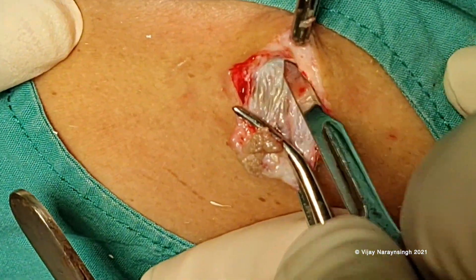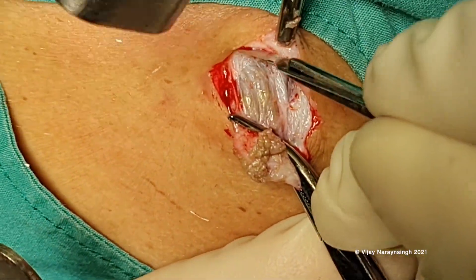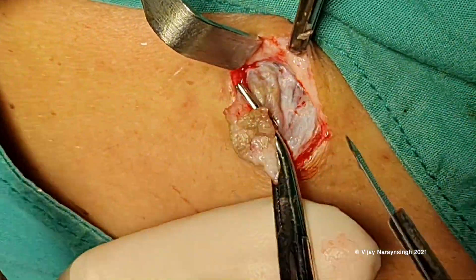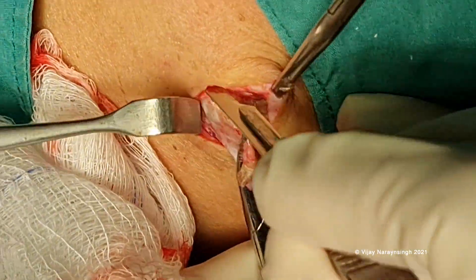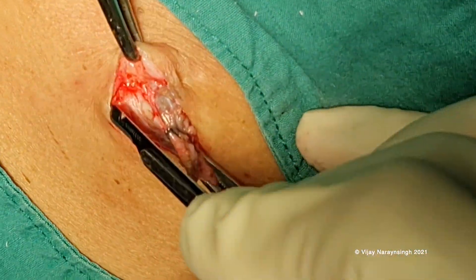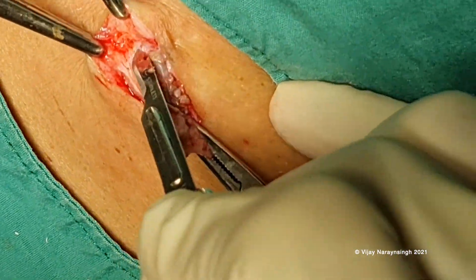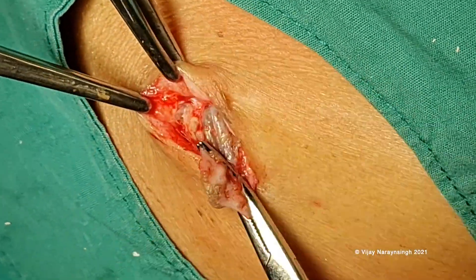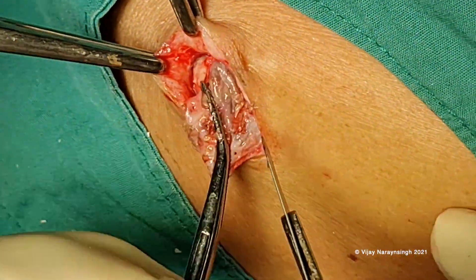However, this is a very thin walled cyst, and this one can still rupture, but with careful resection we can minimize that risk. This cyst was so thin walled, in fact, that even traction on the artery forceps grasping the wall was causing some tearing of the cyst wall.